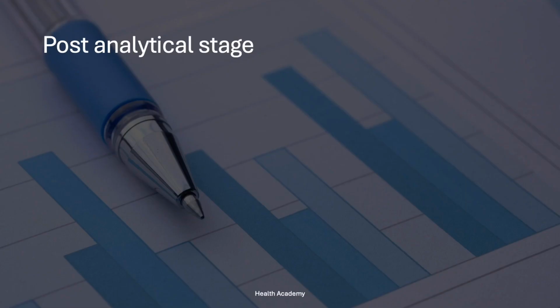Post-analytical stage. In the post-analytical stage, laboratory work culminates with the careful evaluation and release of test results. Although this stage has a lower incidence of errors compared to the pre-analytical phase, it's not without risks. Errors can arise from improper use of test results, the process of reporting critical results, and ensuring accurate transmission of these results. To mitigate these issues, the following guidelines are recommended.